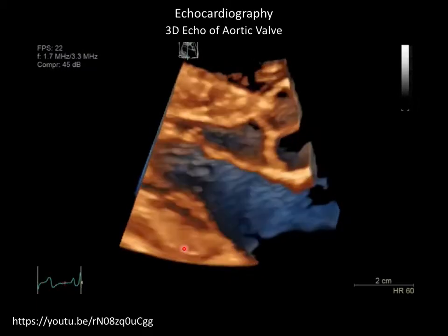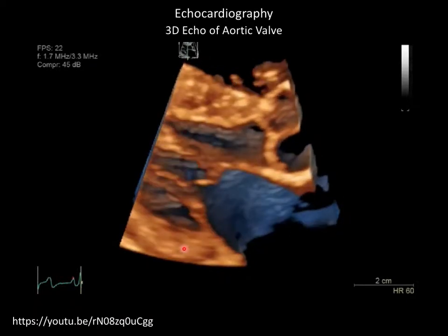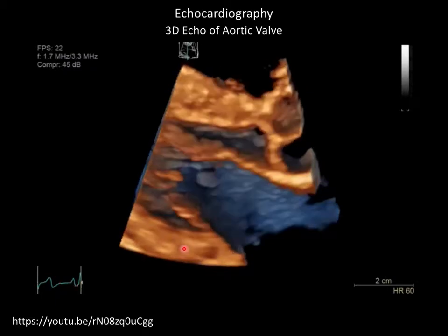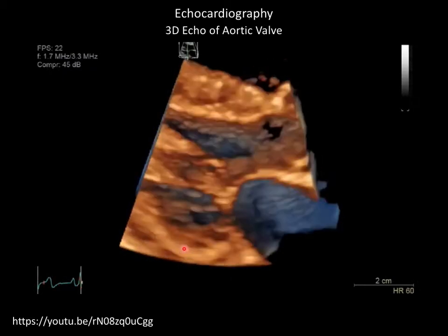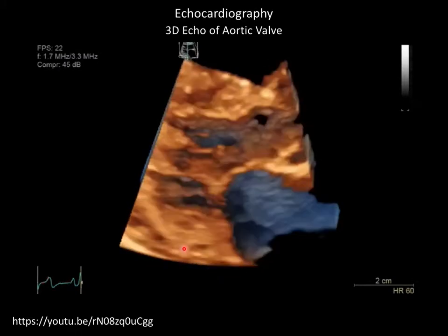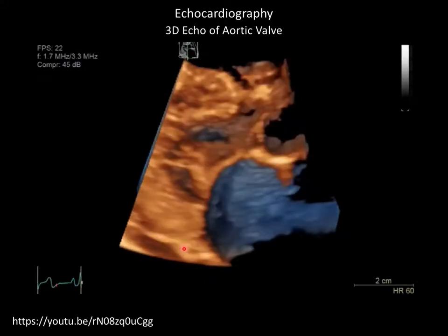For the 1 beat CT scans, how much radiation are you exposing the patient? So that's a great question. For a 1 beat CT scan, how much radiation do you expose the patient to? And usually less than for multi-beat CT scans, right? Because you basically only need 1 turn of the gantry in order to make the picture.